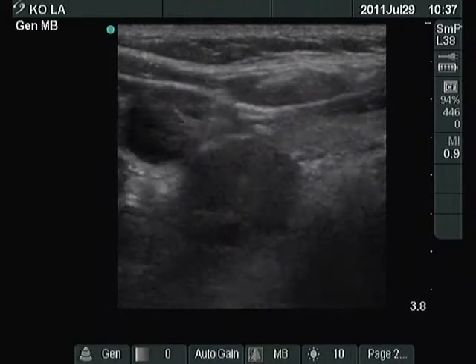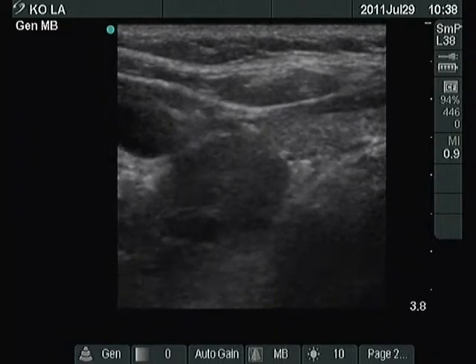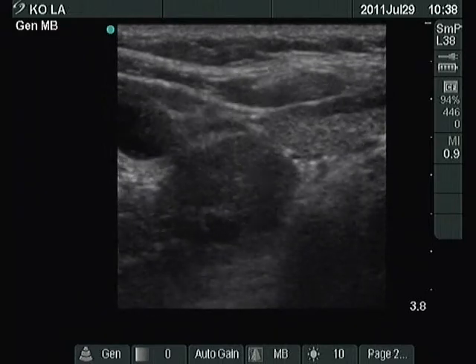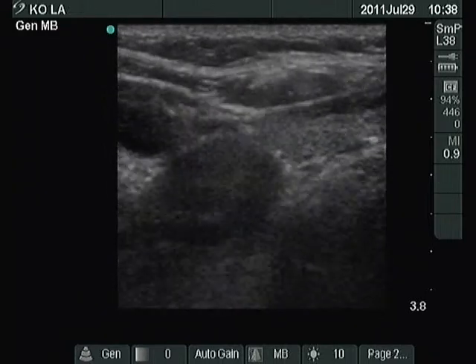Finally, a US-guided FNAC is shown. The tip of the needle can be seen well.